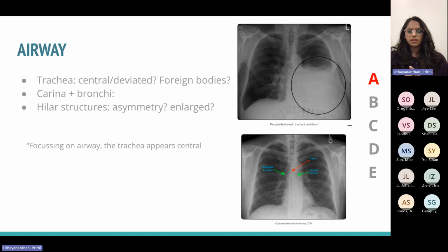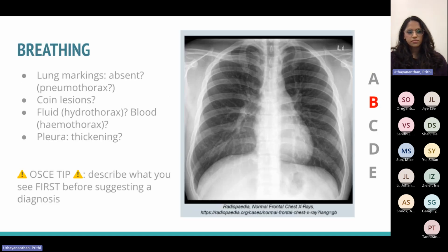And yeah, that's just another thing to make sure you remember, is to always make sure that the patient isn't rotated, because that can distort the way that the trachea looks, and it could just look deviated even when it's not.